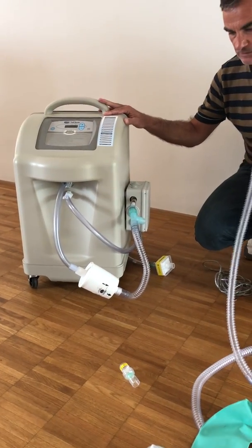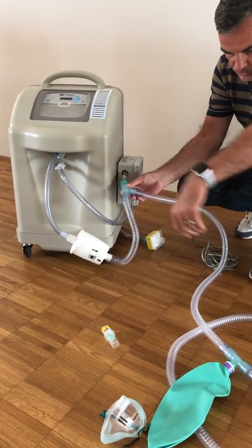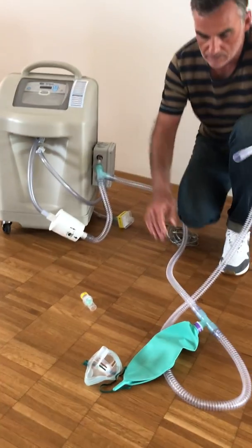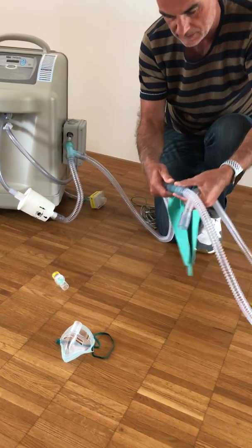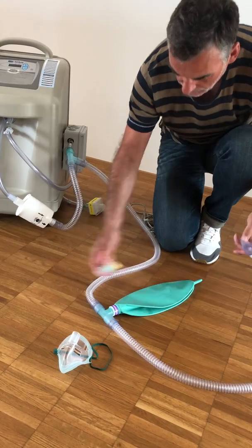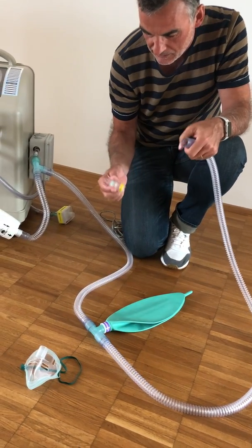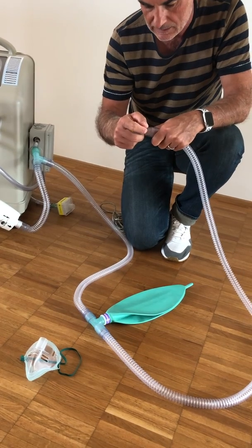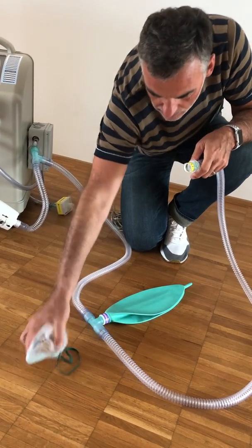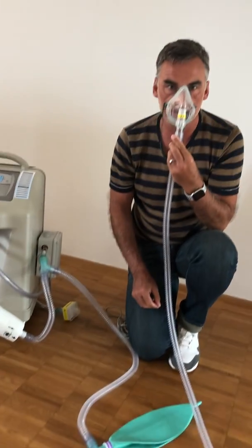Now you just have to connect the breathing circuit to the T-connection. Then you have this bag — this is just to have a little bit more reservoir for breathing. And then you connect this and this to the mask. Now you are more or less finished.